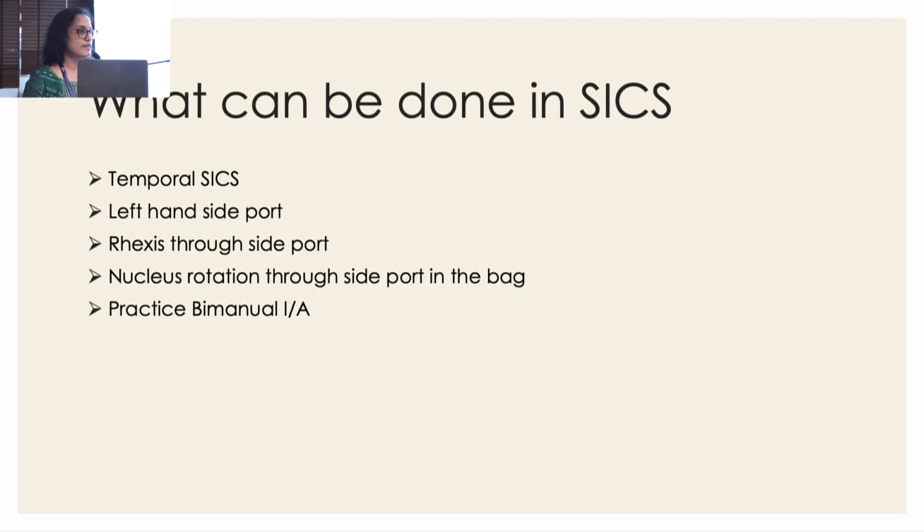Many of the SICS surgeons do the SICS through superiorly or supratemporally, but sitting temporally, the anatomy and everything is a little bit different. So start to do temporal SICS if you're doing SICS, and also do a left hand side port.